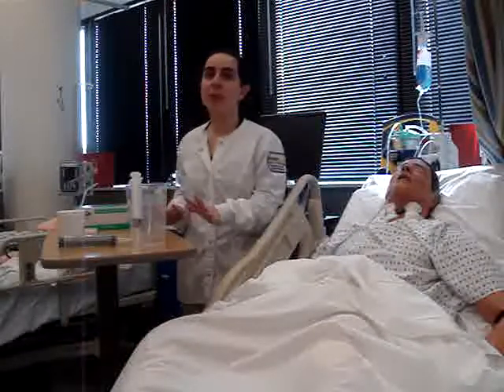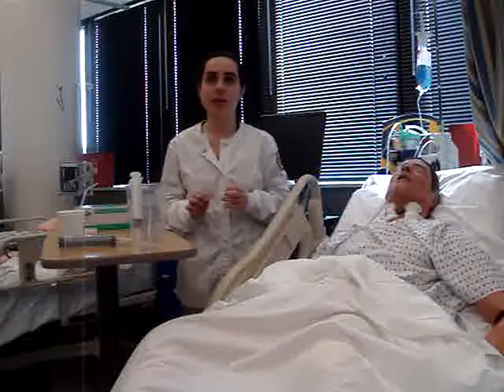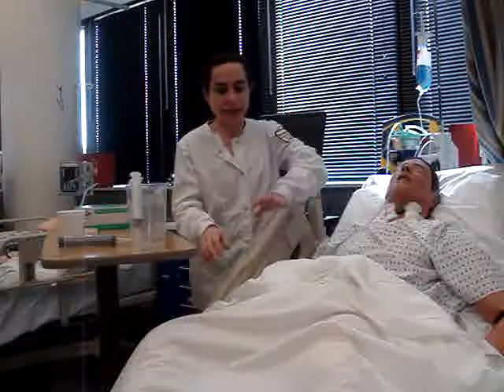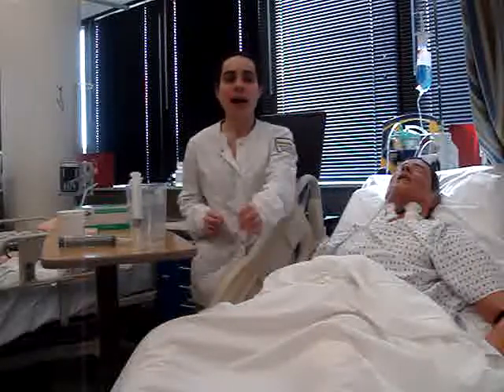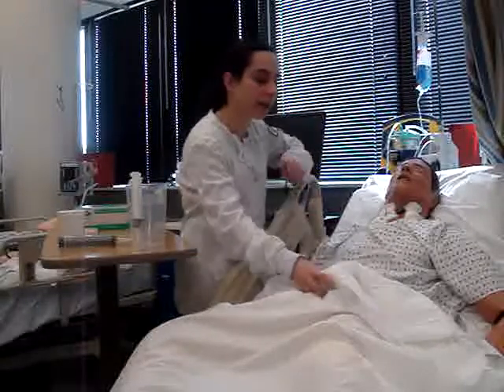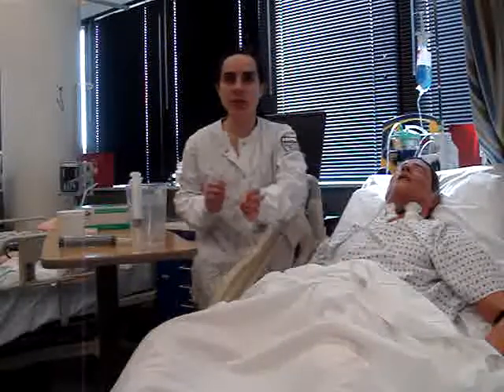I will gather all of my equipment and I will check the expiration date on the formula that I'm going to use. I'll perform hand hygiene, identify the patient by 2 identifiers. I will assemble my equipment and the way I'm going to use it, and then I'm going to perform an abdominal assessment of my patient.